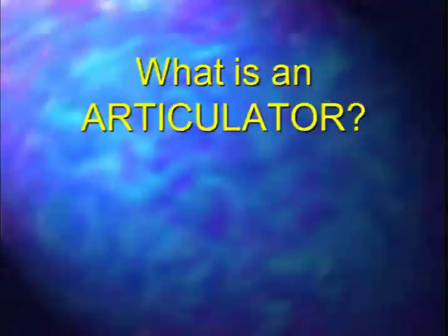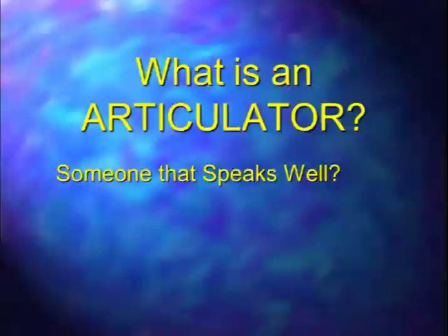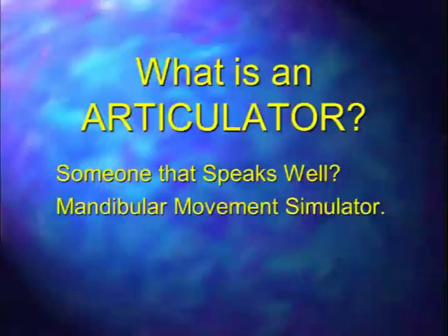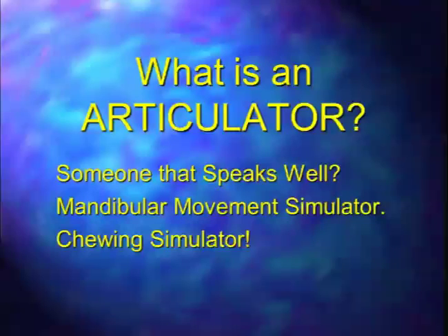So what is an articulator? Well, the average person might ask if that's someone that speaks well. Dentists like to call them mandibular movement simulators, but I like to simply call them a chewing simulator. What we're trying to do is duplicate the way someone chews, which is a very dynamic three-dimensional movement that includes an opening, lateral, and closing movement.